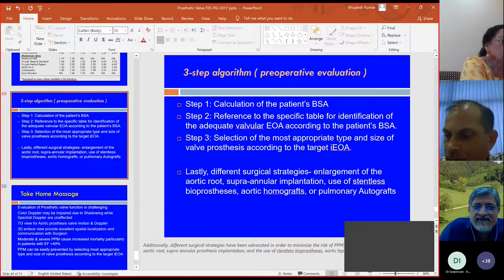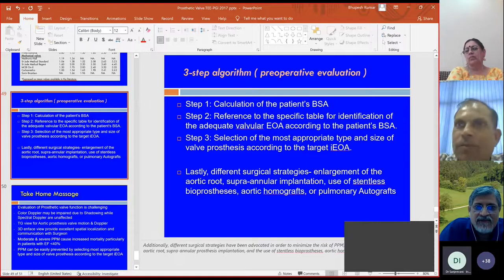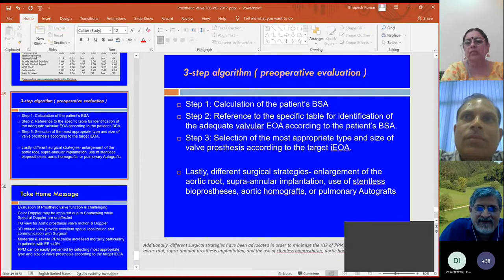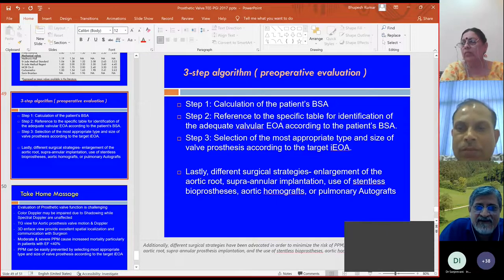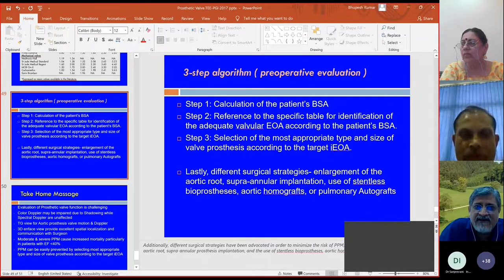As the discussion went, other areas such as whether the aortomitral curtain is calcific, or whether the aortic root is calcific, are also very important to identify. If you suspect severe calcification, porcelain aorta, it may be difficult for a surgeon to replace a valve. So it is necessary to identify porcelain aorta. If you have porcelain aorta, then you definitely require radiological investigations. Or if there is severe aortomitral calcification, it may affect even the mitral valve stability after you replace it.